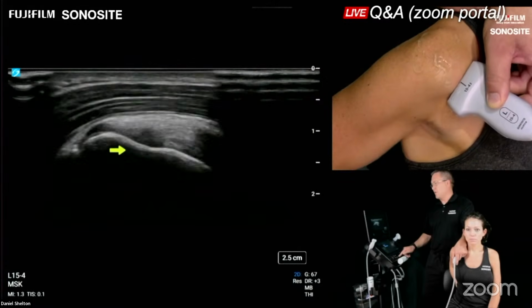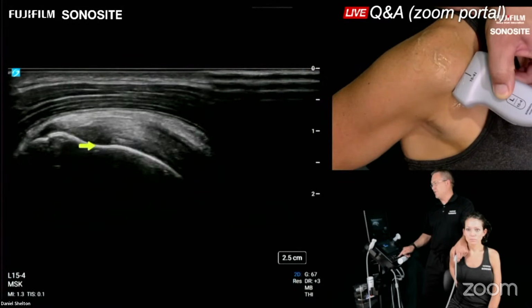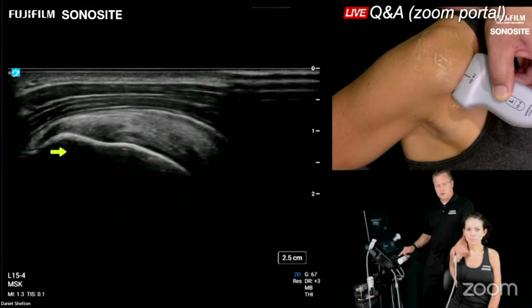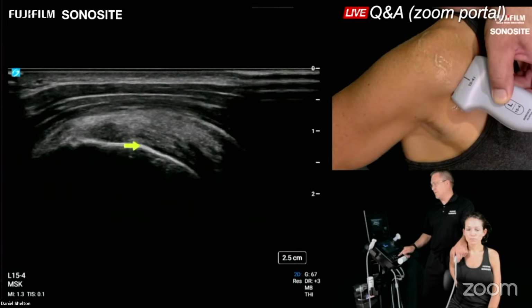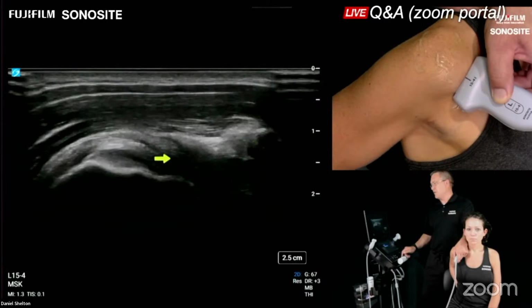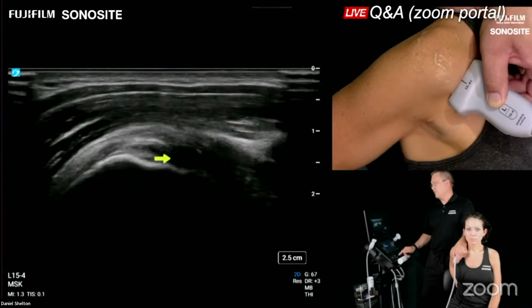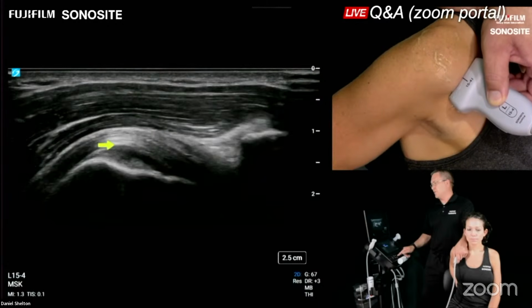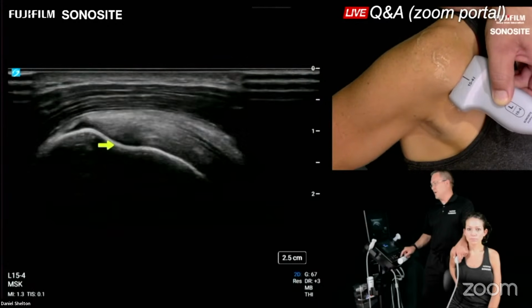And I'm going to check my work again as I go to the anterior greater tuberosity. I'm going to watch the greater tuberosity fall, and that's how you know you're going to enter the biceps groove, basically. But I'm going to follow this part right here where tuberosity meets humeral head, and we should see that arc shape of the biceps as I go more anterior there. So there's our anterior marker, our reference point, our lighthouse to make sure that we've evaluated the anterior supraspinatus.